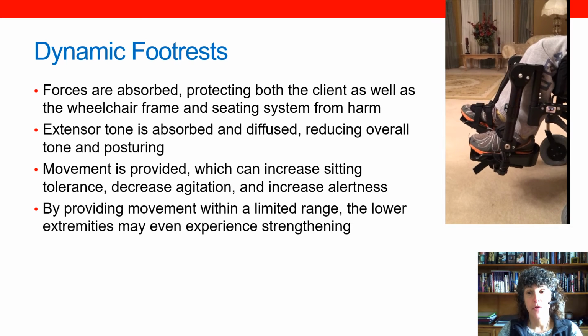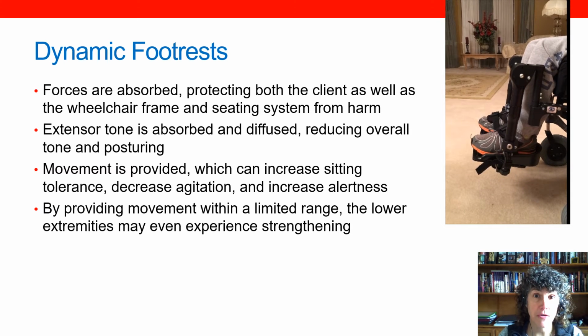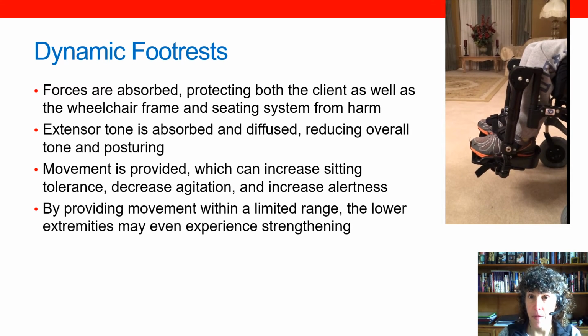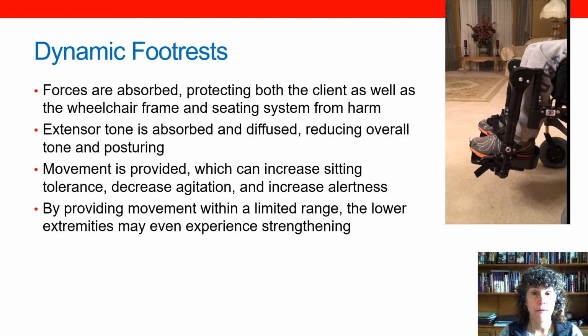So dynamic footrests are designed to absorb forces, protecting the client as well as the wheelchair frame and the seating system from harm. Many clients who have a lot of extension have been known to break a component of the footrest hanger, or at the very least move those foot plates way out of alignment. So extensor tone is now absorbed and diffused, and that reduces overall tone and posturing for the client.